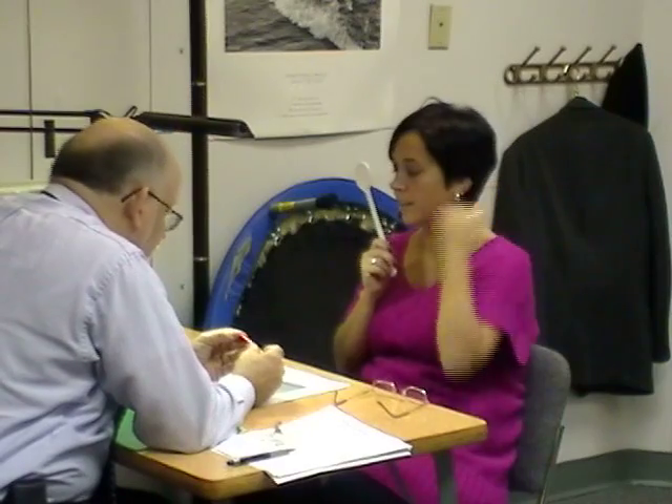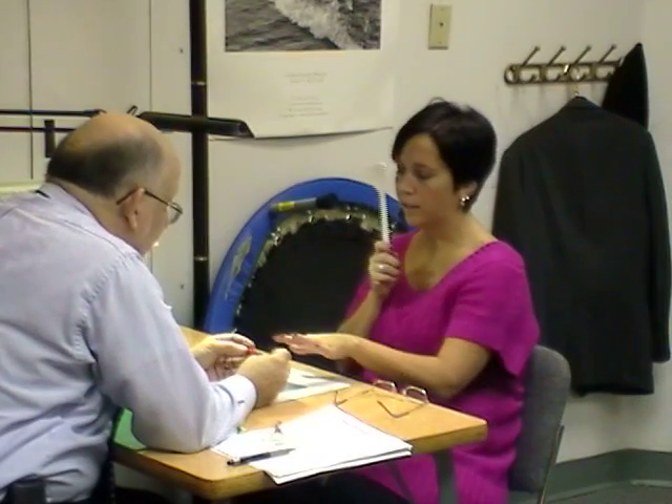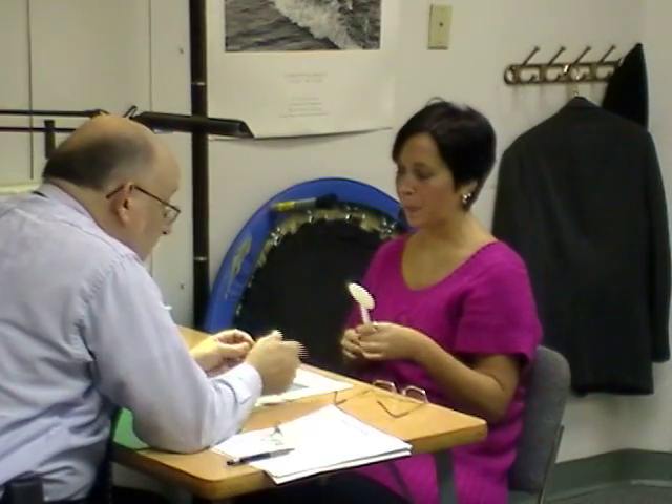With the right eye covered — yeah. How much difference? Like a 10% — one's a little brighter and the other one's just a little red. That's good. We'll repeat this after you've had the left eye. Actually, why don't we just do this right now? See, with the prisms on.